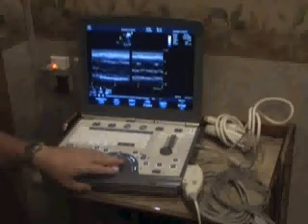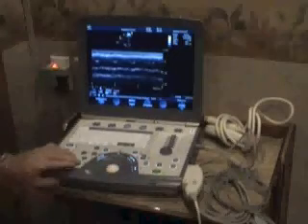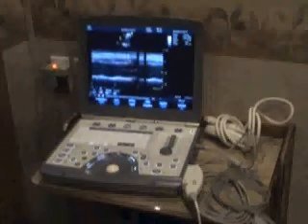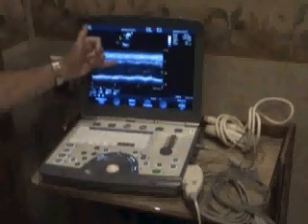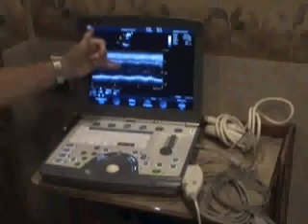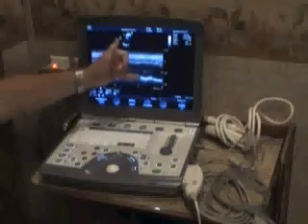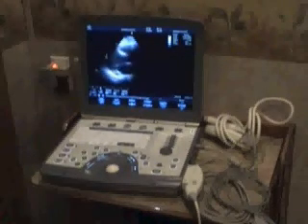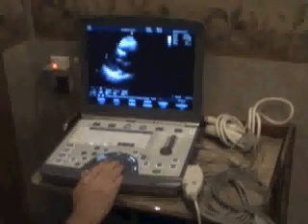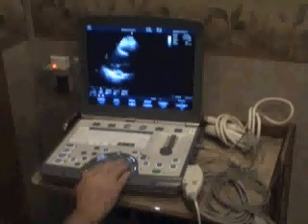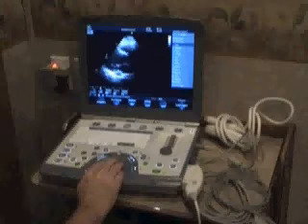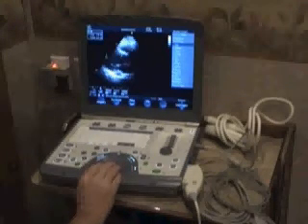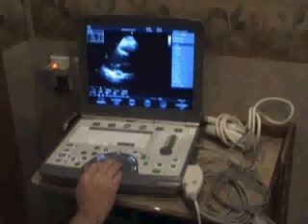Let me go back and take a quick one of that aorta again because I didn't save it — freeze and save. Then we're going to come over and take an M-mode of the left ventricle, just past the tips of the mitral valve. What you'll see in this image is the intraventricular septum. This black area is your LV, and this bottom area is your posterior wall. We don't take measurements in M-mode, but we would go back and get a good solid scan, freeze it, getting the ventricle as wide as it'll get, and take measurements.